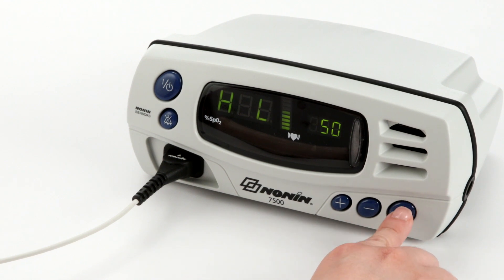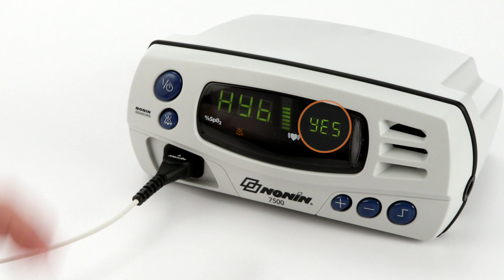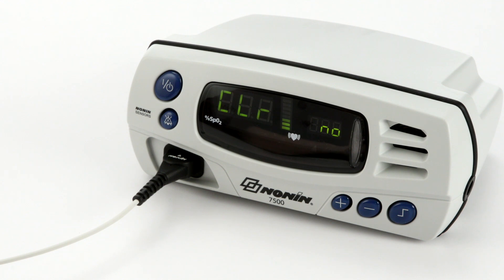To set your 7500 to hybrid averaging, press the limits button until the display reads HYB. Press the plus or minus button until the screen reads YES. Your device is now set to hybrid averaging mode. To save this setting, press and hold the alarm silence button while briefly pressing the limits button. The hybrid averaging mode setting will save for future use — you will not need to reset it each time you turn the device on.